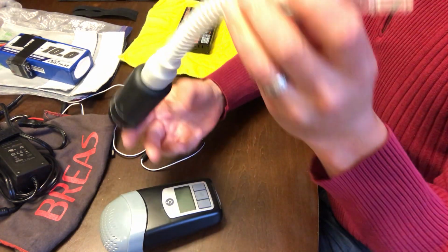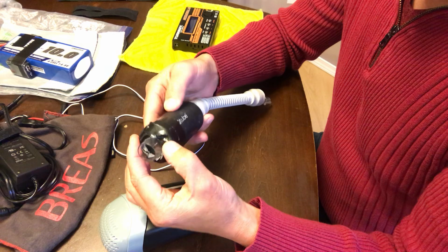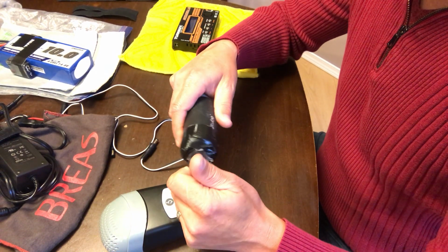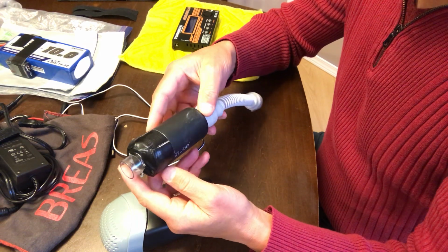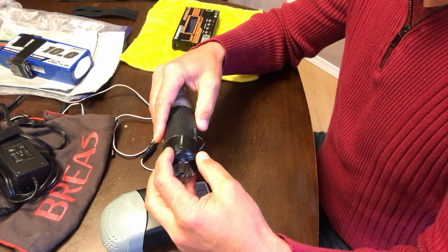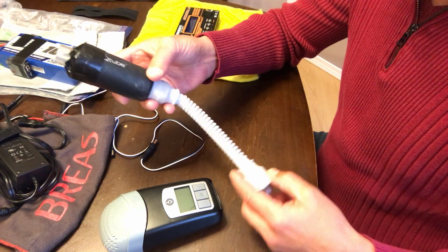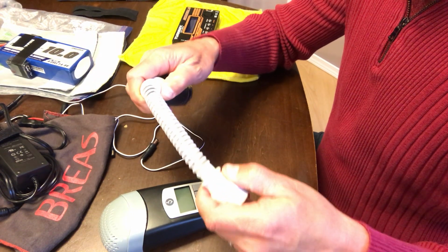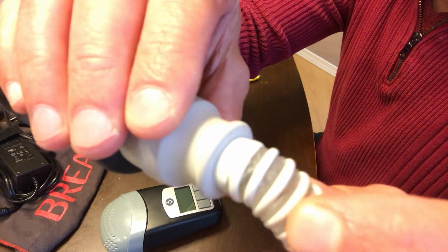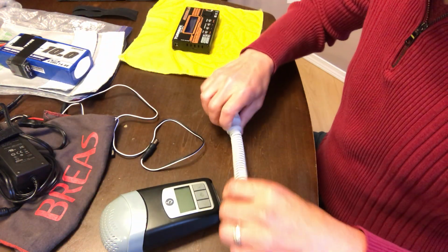This particular one, we recommend using this quiet tube, which I bought online. And you can see I have a bunch of gaffer tape, duct tape on here because it broke as I was trying to pull the hose off of it. So I'm not sure I can recommend this tube, but it's the only thing on the market and it is serviceable. It should come apart, but I pulled too hard and broke it. You shouldn't be able to break it so easily. But this part is really durable. I've been using this for a month in New Zealand, and you can see here that it is starting to crack and dry, so I don't know how long this will last, but it's pretty good.